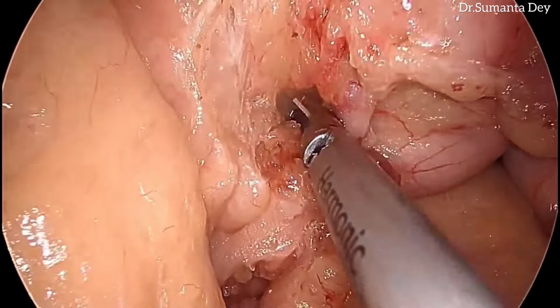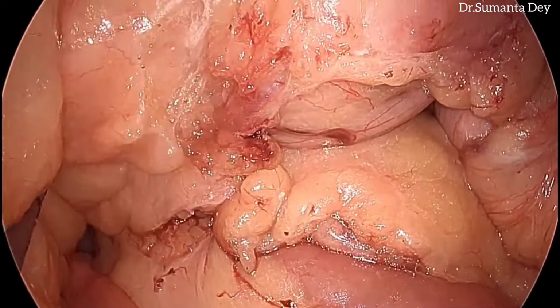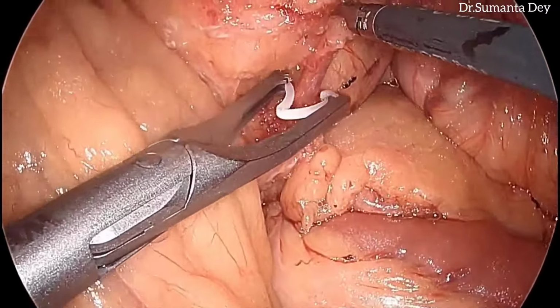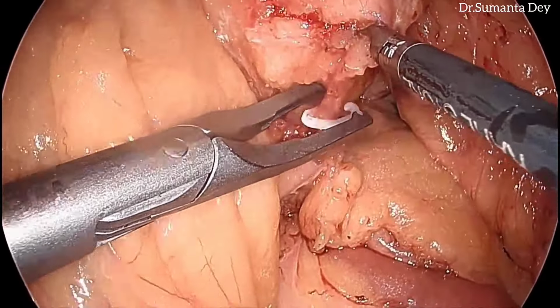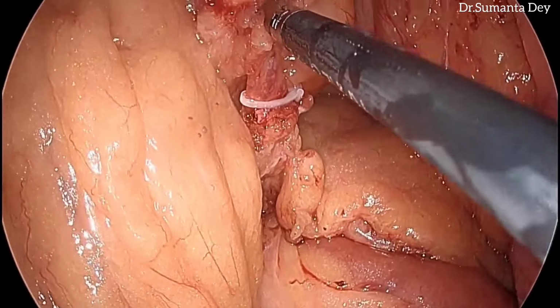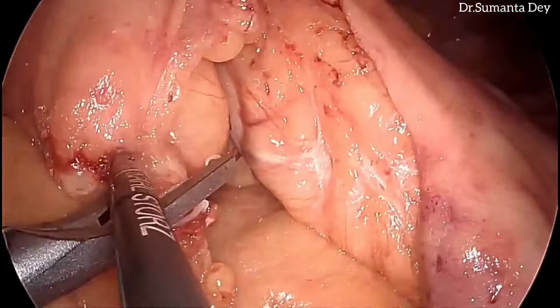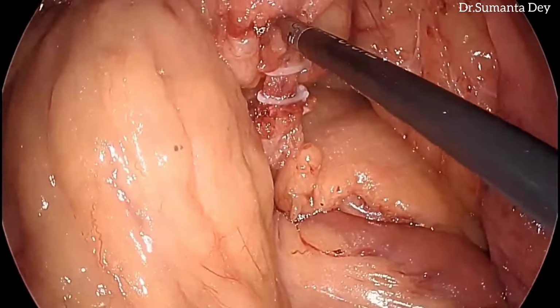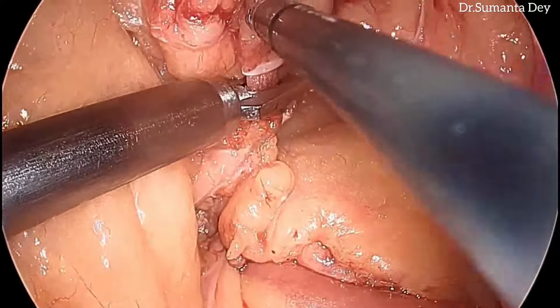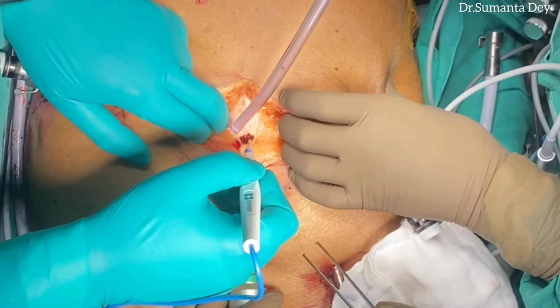So I have dissected the left middle colic vein 360 degrees, and then with proper traction and countertraction I have ligated it with Hem-o-lok near the root of the left branch of the middle colic vein. Again Hem-o-lok, proximal 2 and distal 1, on the left branch of the middle colic vein, and then complete mobilization is done.